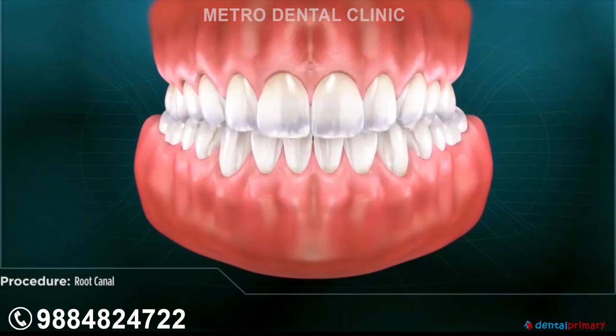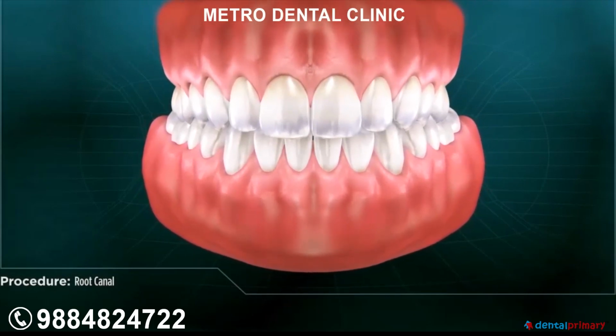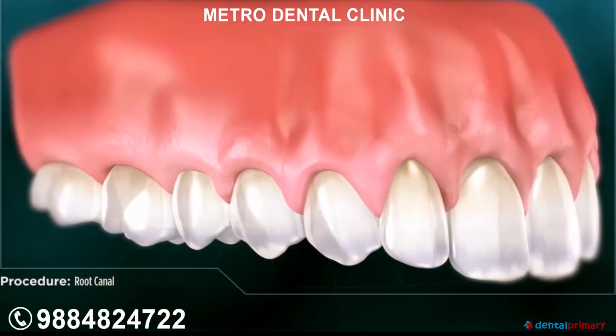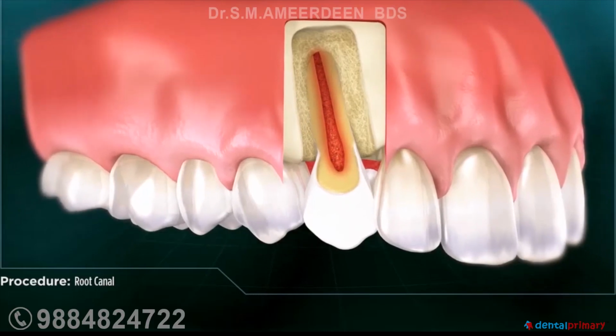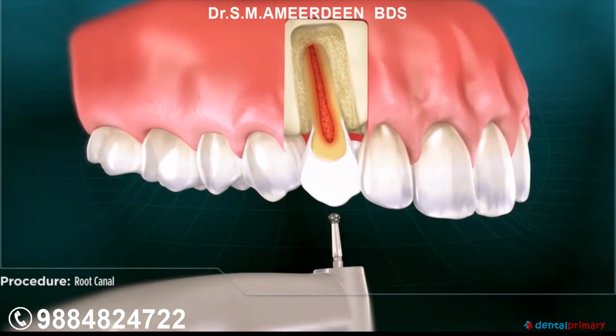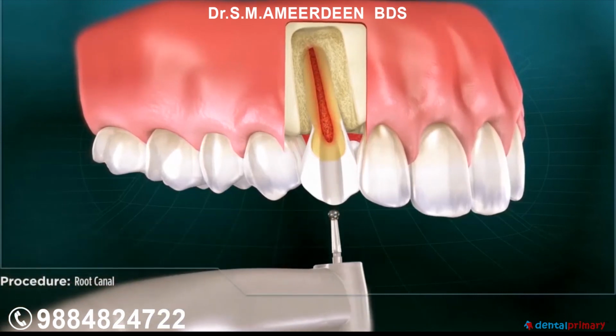A root canal is needed when the nerve of a tooth has become damaged by injury or infected by decay. This procedure saves the tooth and can help restore it to natural function. For the first step of this procedure, your doctor numbs the area and then creates an opening in the tooth to access the root's interior.